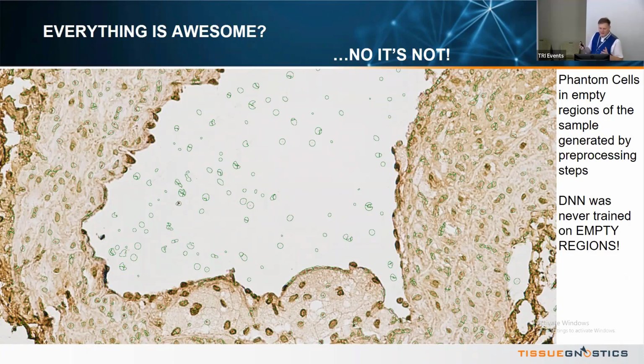All the training images that we used showed tissue on all the pixels they consisted of. There was never an outside of the tissue or a hole in a tissue. The whole image was tissue. And so the algorithm kind of learned, okay, everything is tissue. And the data entity, empty or outside, was unknown.